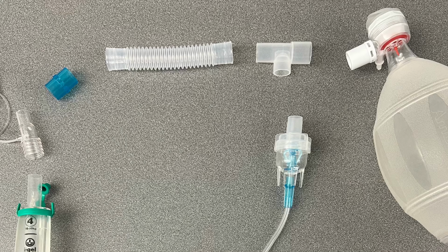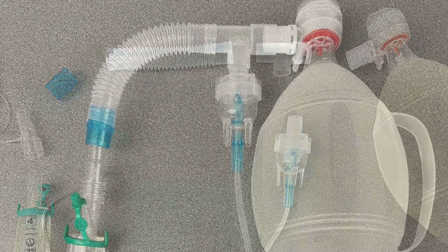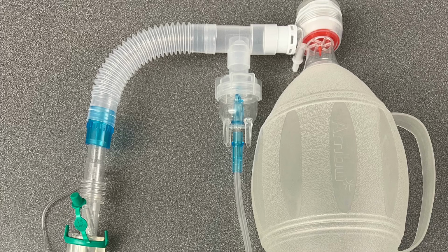to connect the BVM. We then have corrugated tubing, which is connected to the capnography through a blue adapter device. The capnography will then be connected to the advanced airway. Pictured here is a complete setup with all of the devices connected to each other.